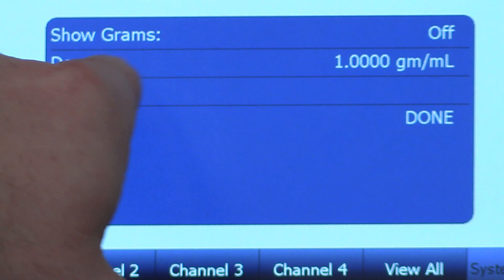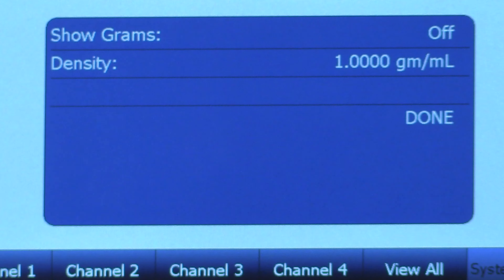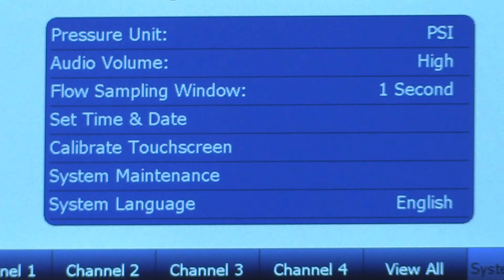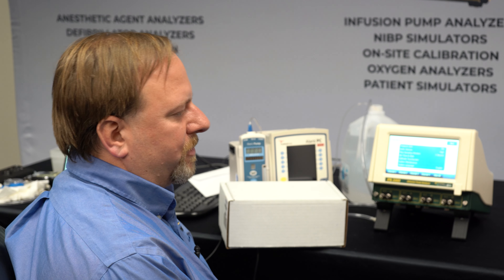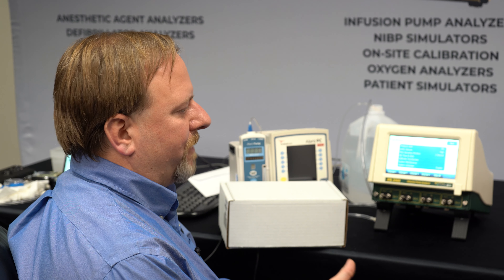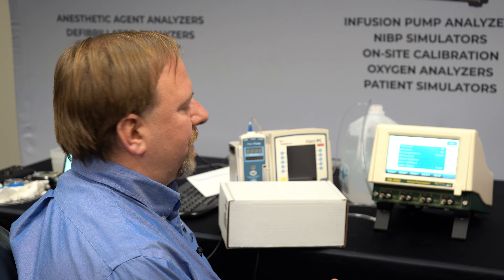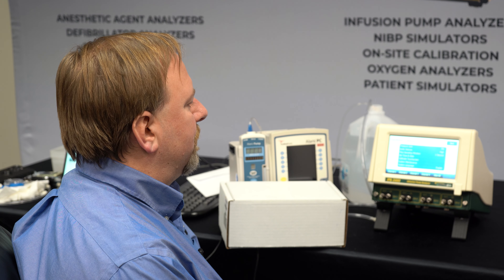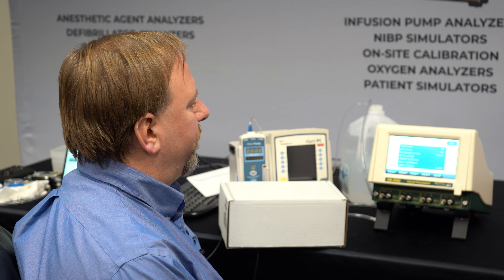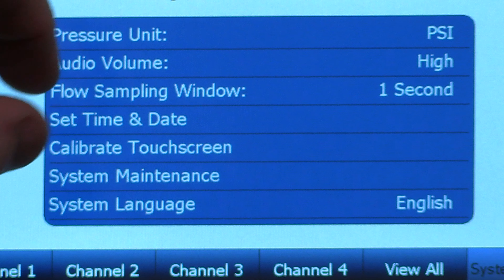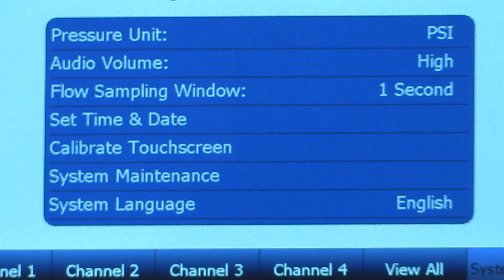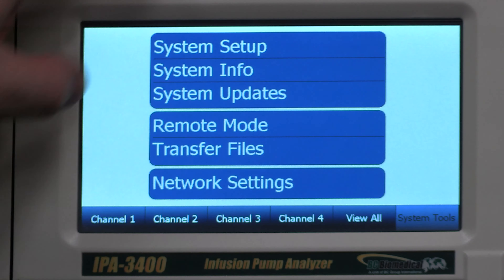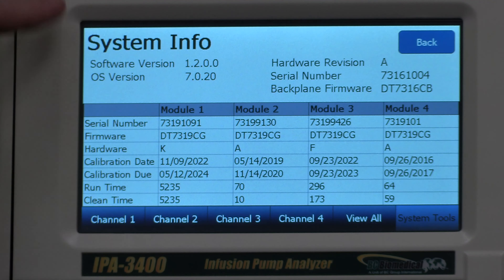We also have an option for whether we want to display the grams mode. The grams mode allows us to show grams measurements. We have a density which is based on our altitude and we can display grams in our measurements. Some service manuals want you to measure in grams rather than milliliters, so rather than having to use a scale, you could use the IPA 3400 and just have it display how many grams equivalency was measured based on the flow and the volume measured during the test.